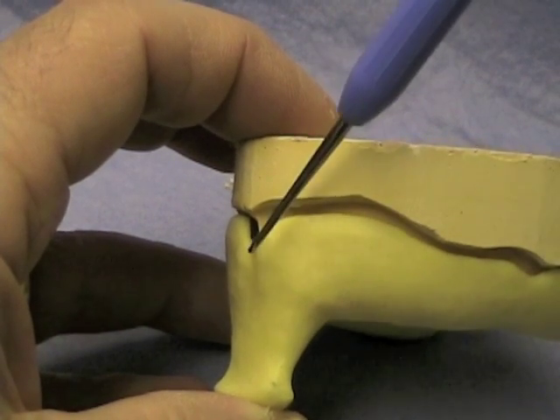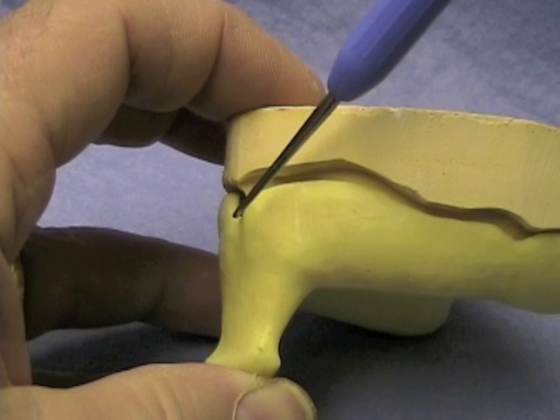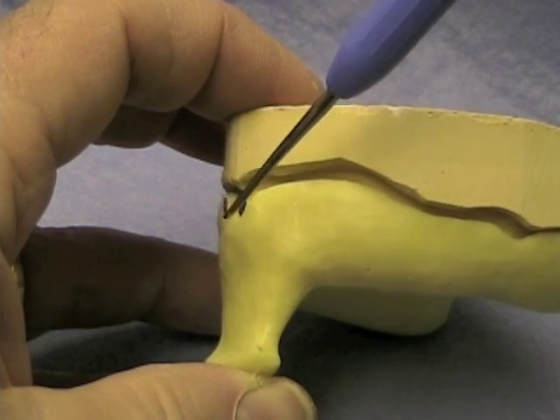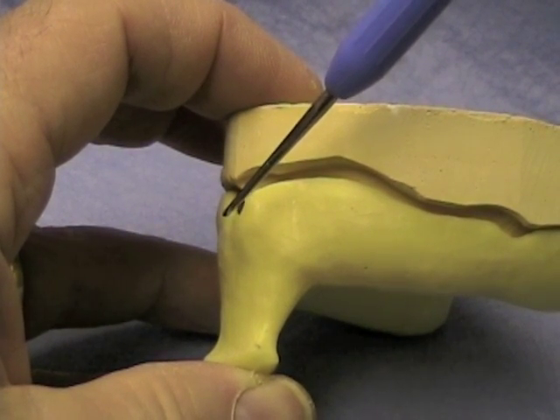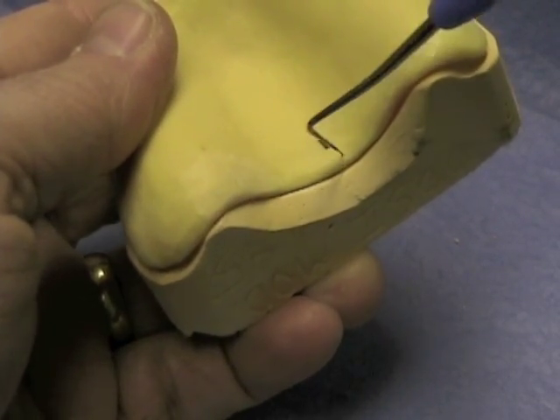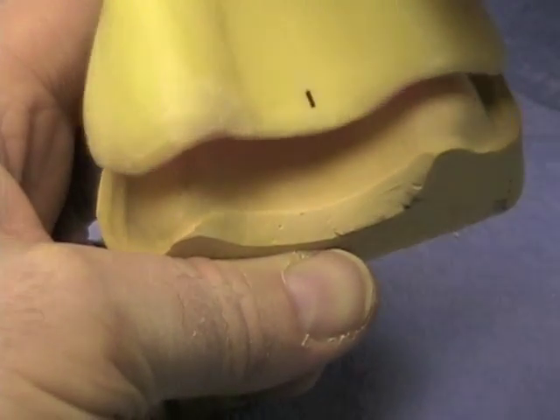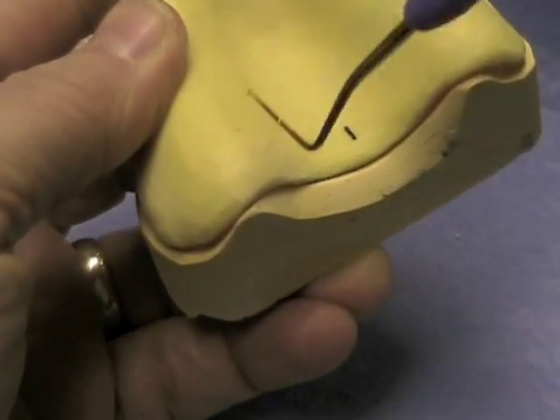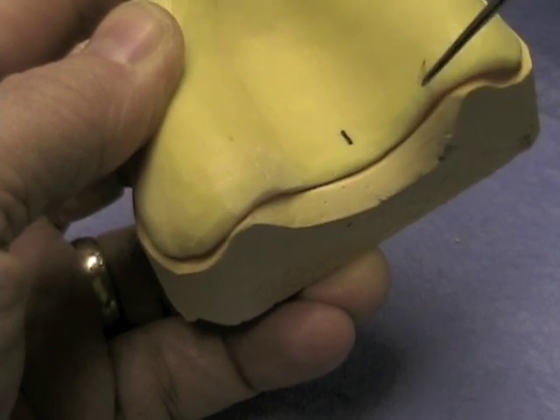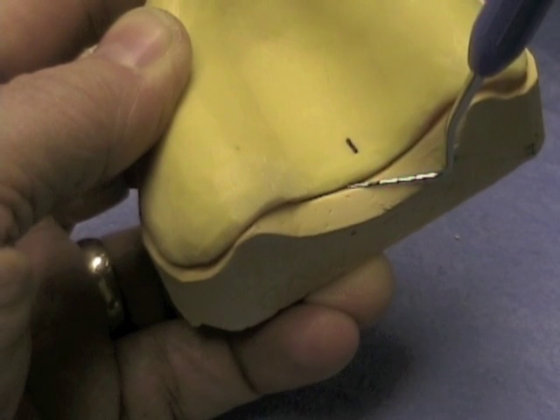When you look at the tray from the side, you should see that the flange of the custom tray is closely adapted to the residual ridge — there shouldn't be a big space in this area. At the very back, the tray should be extended to the very back of the cast where you drew your vibrating line. It shouldn't lap over the land area, and it shouldn't be short of the hamular notches, the tuberosities, or the vibrating line.